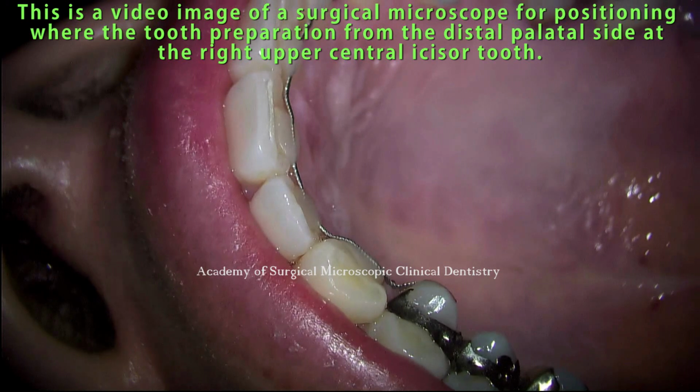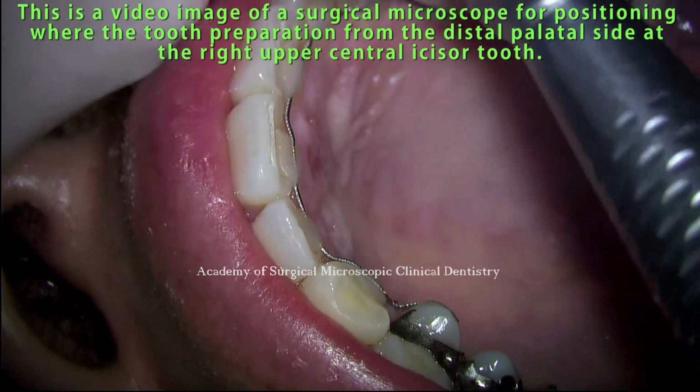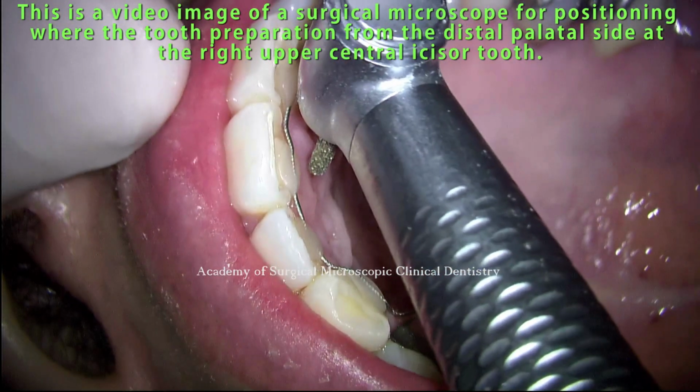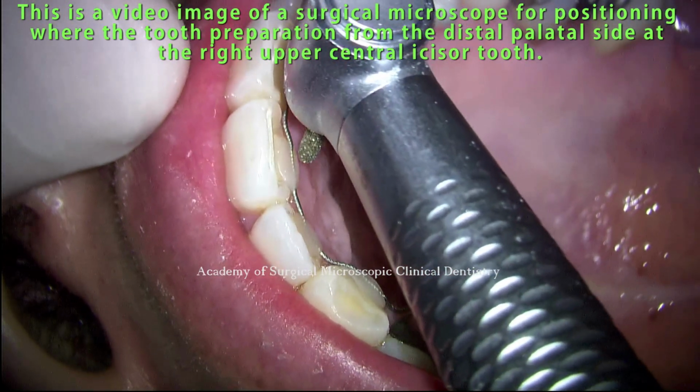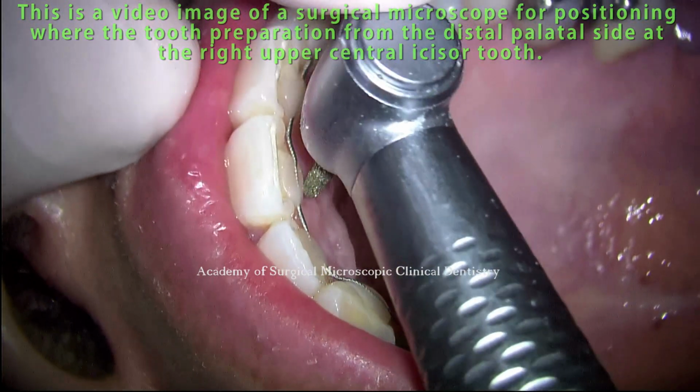This is a video image of a surgical microscope for positioning where the tooth preparation is performed from the distal palatal side at the right upper central incisor tooth.